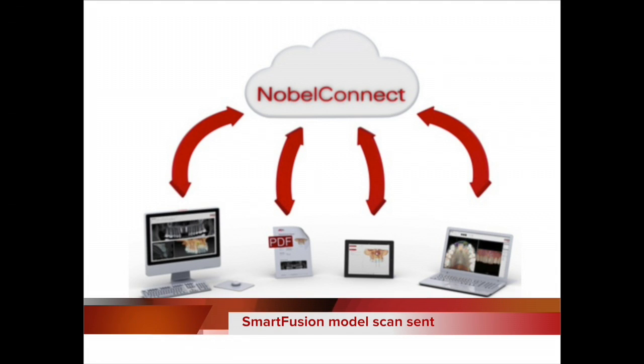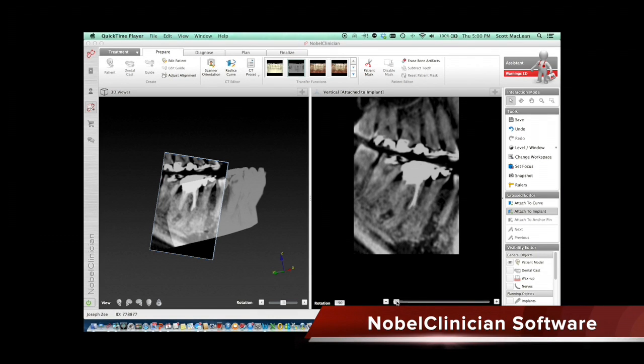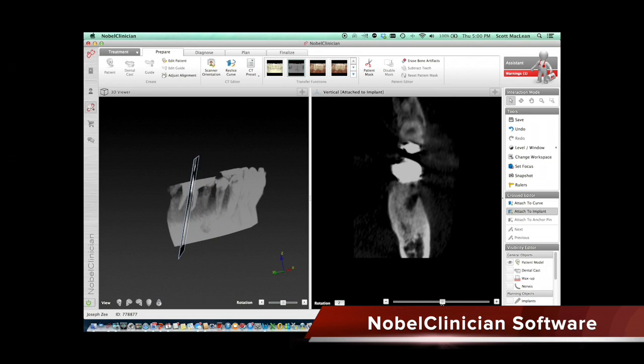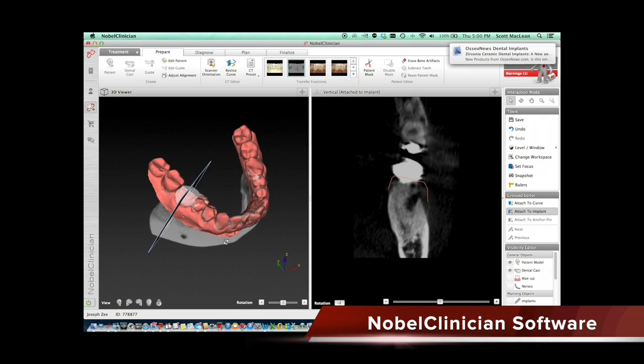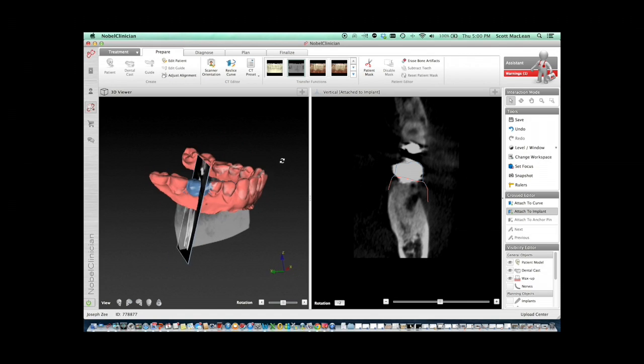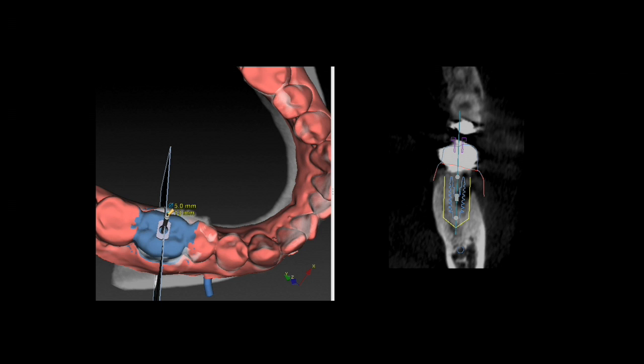The Smart Fusion is my favorite part of this whole procedure. Using the Nobel Clinician software, we take the CT, push a few buttons, and then in comes the scan that was done on the Nobel Prosera software. Once the scan gets lined up on the original CT scan, you have a very accurate representation of the patient. We know where the tooth is supposed to be, where the nerve is, the angulation of the bone — these features give us a GPS of the patient that is extremely valuable.